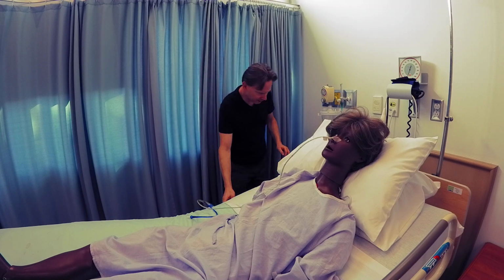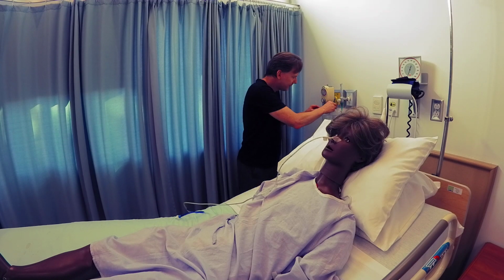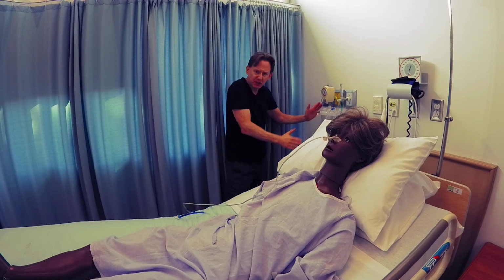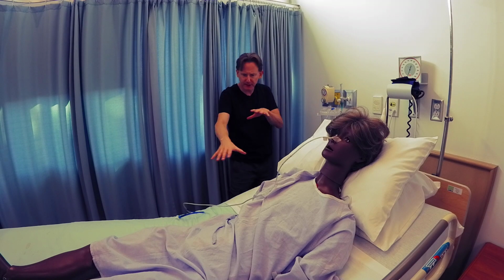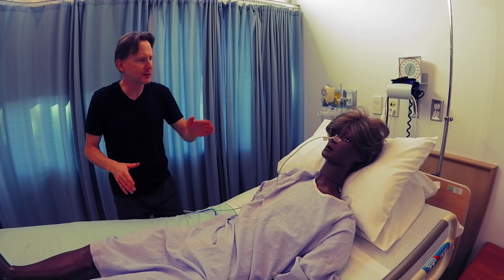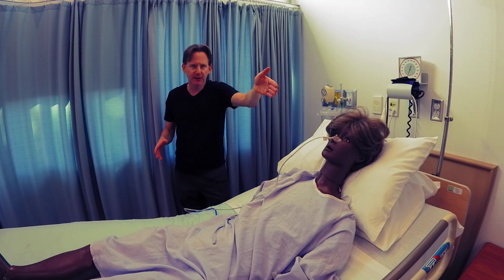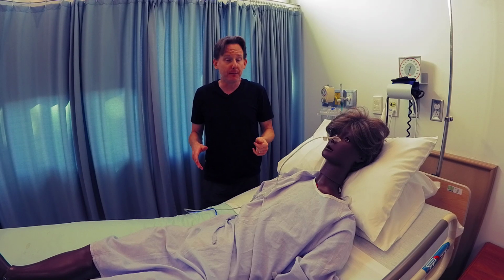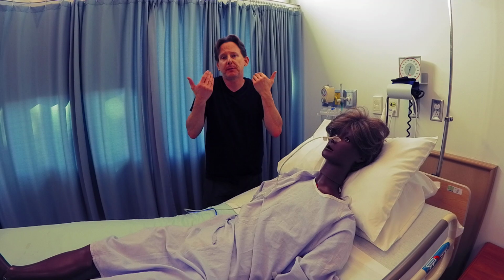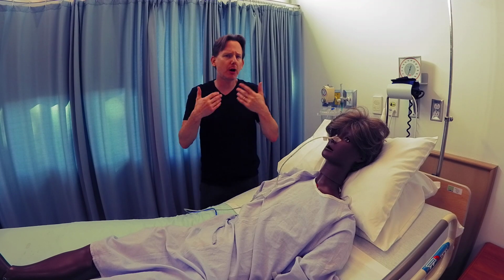So assuming you've checked all that and you still don't have flow, nothing's still flowing, then you have to assume, if it's in the right place, your whole suction machine is working properly, everything's hooked up, there's no kinks, and the adapter's on right, that there's a blockage somewhere in the NG tube. Maybe some gastric contents got stuck there. Maybe it's even stuck to the side of the stomach wall, sucking on the stomach wall until no liquid can be sucked out.